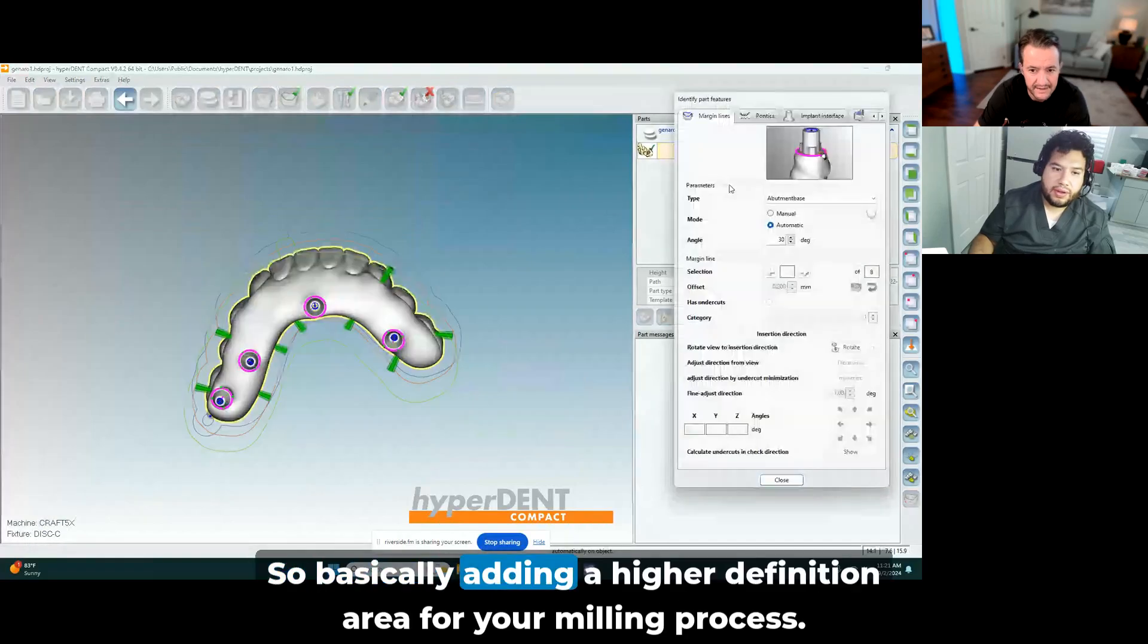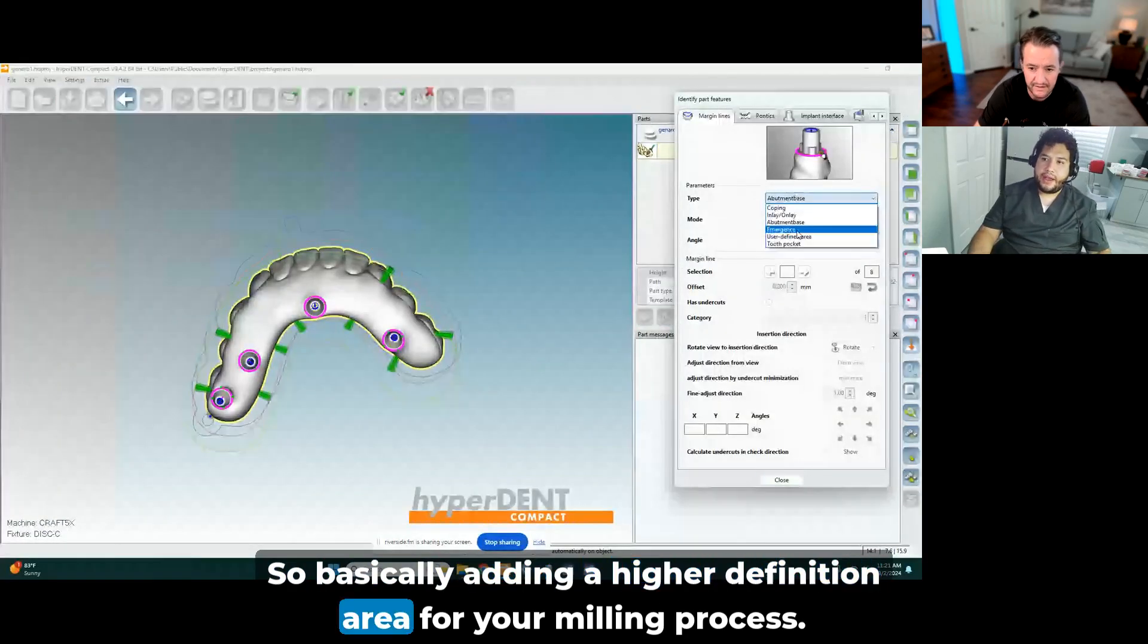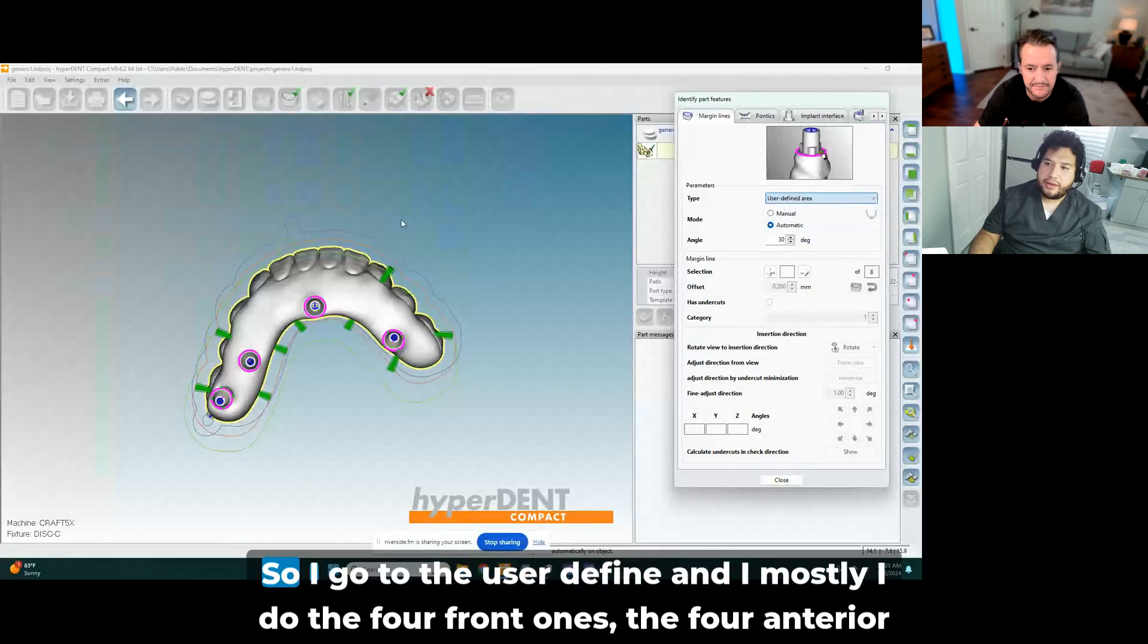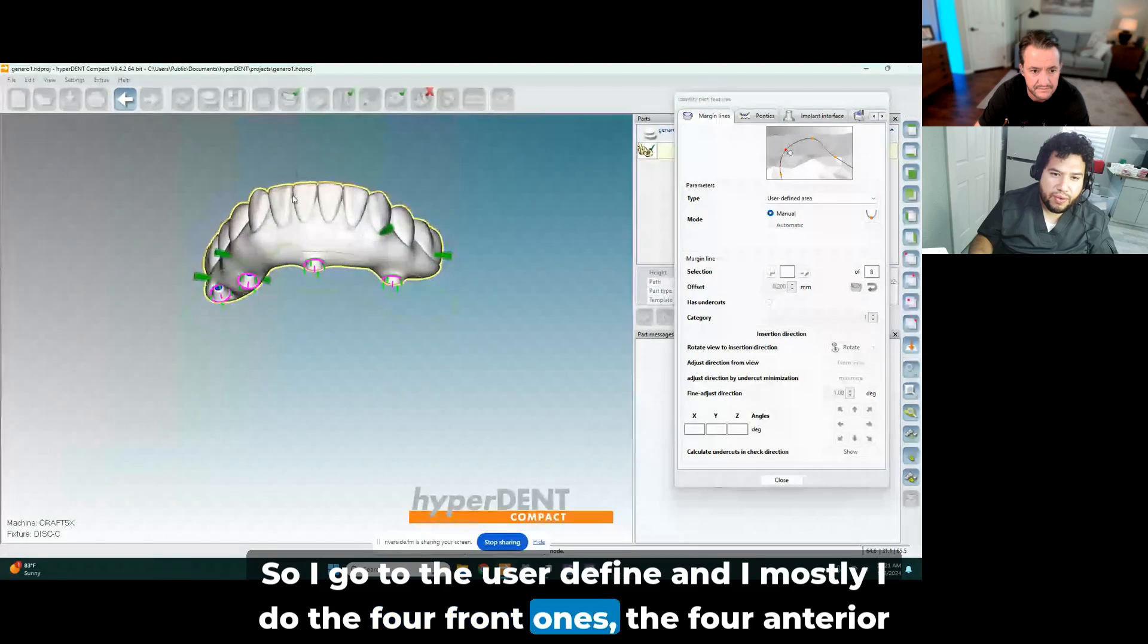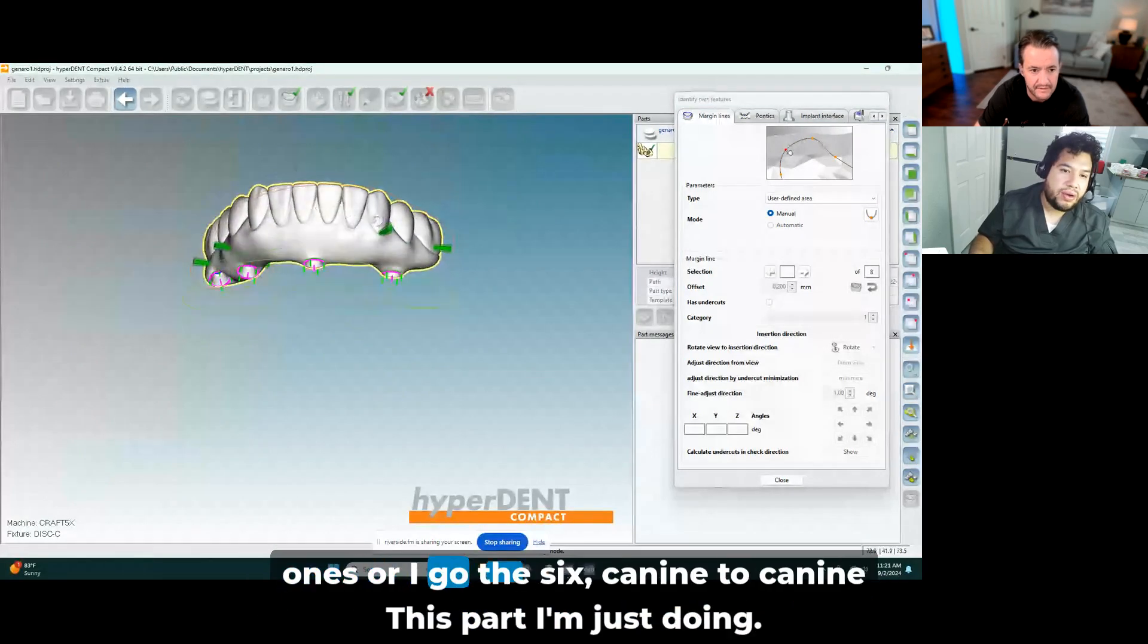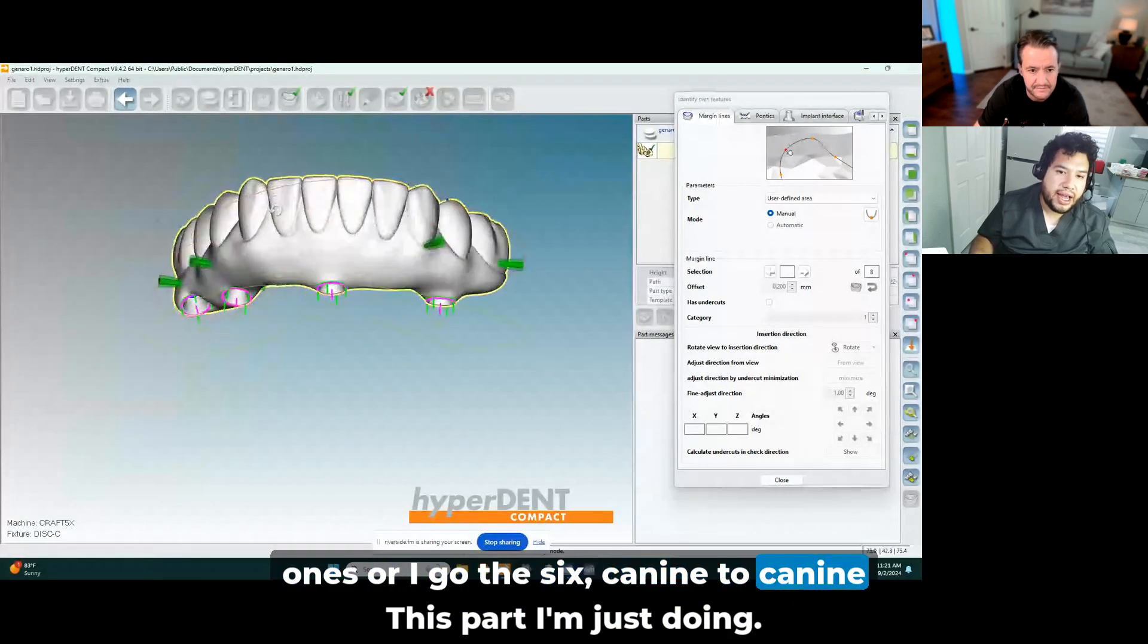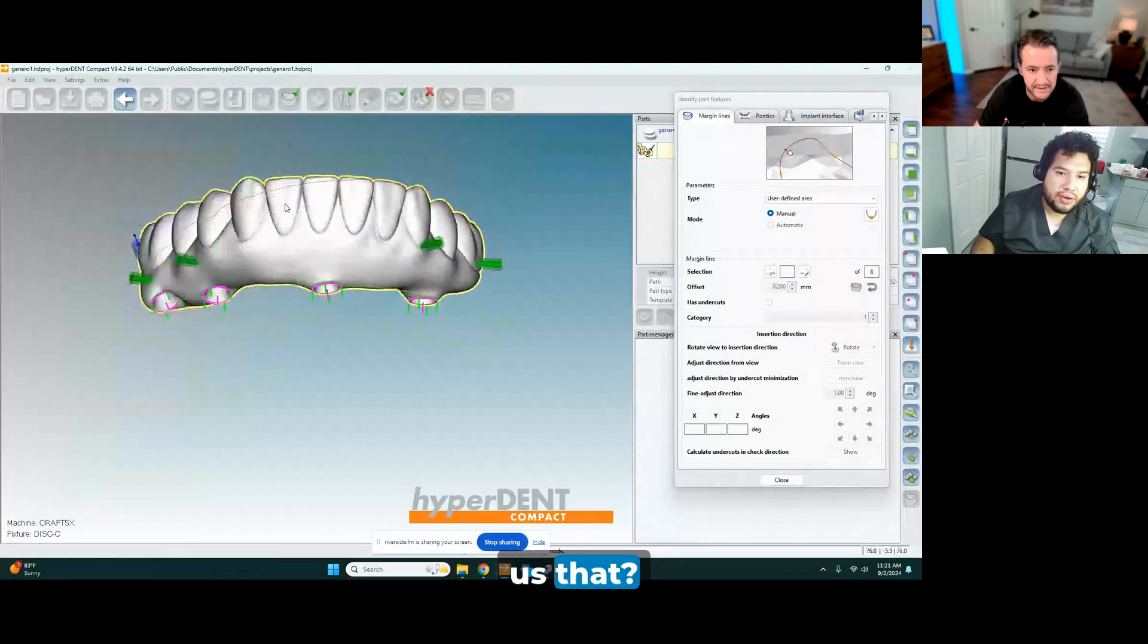So basically adding a higher definition area for your milling process. Yes, correct. That's it. So I go to the user defined. And I mostly do the four front ones, the four anterior ones, or I go to the six, canine to canine.